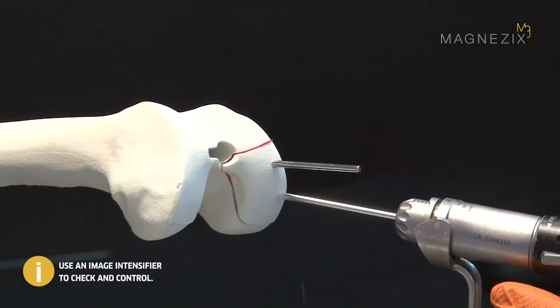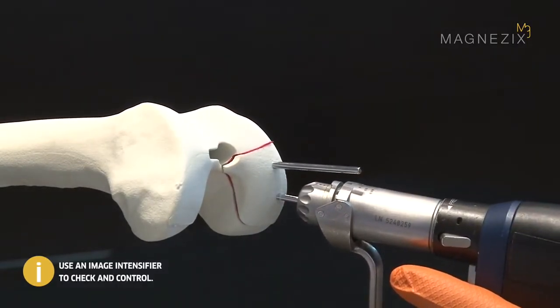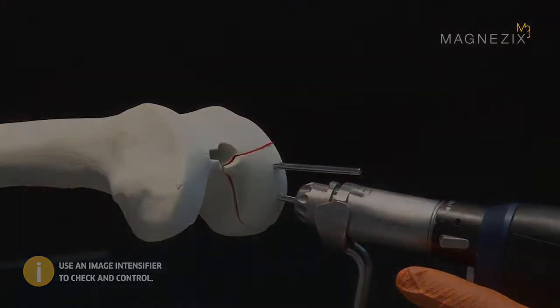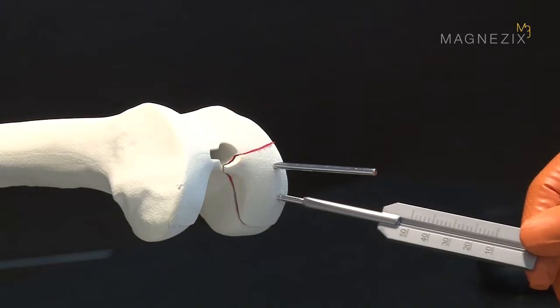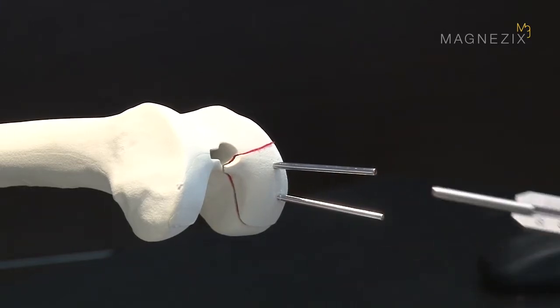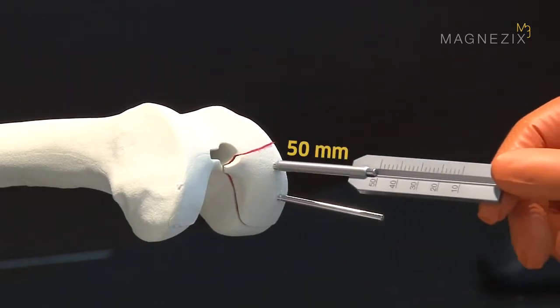If necessary, use an image intensifier to check the depth of the wire. The depth of the reduction wires is determined using the measuring device. In our case, the length for both pins is 50 mm.